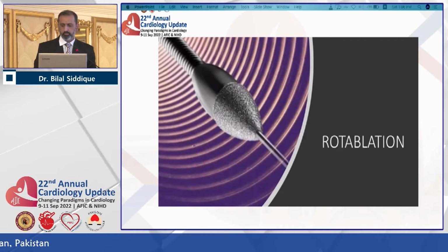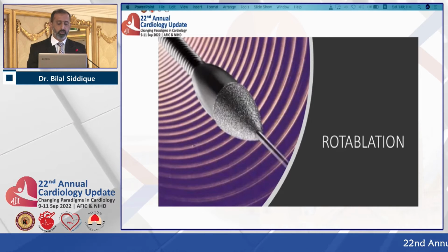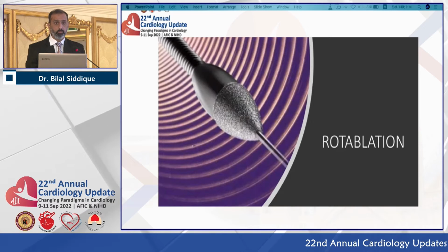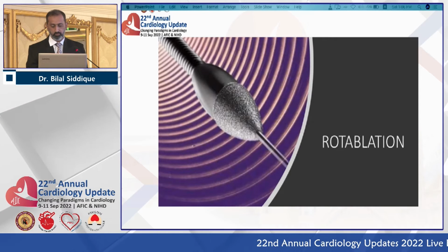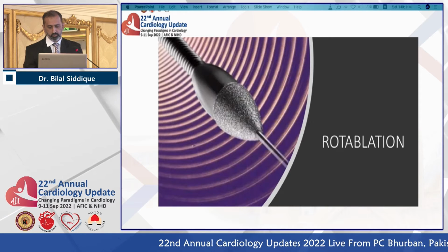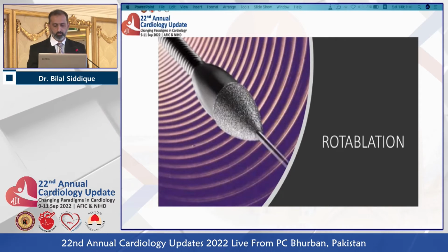Rotational atherectomy consists of a nickel-coated brass burr, the front half of which is covered with cutting diamonds. It spins very fast around its axis, up to 3000 revolutions per second, generates a lot of friction and heat, and thus requires continuous lubrication. It's important to note that the rear half of this burr is not covered with diamonds.